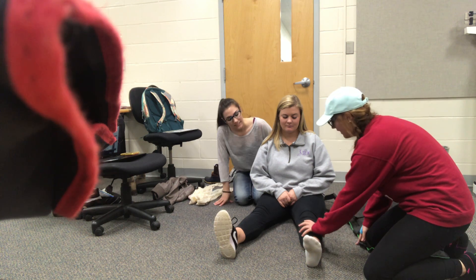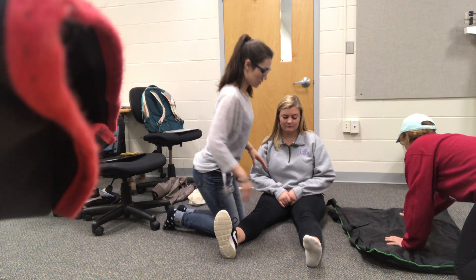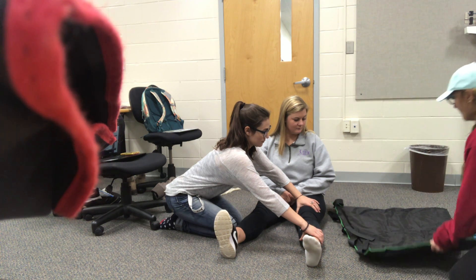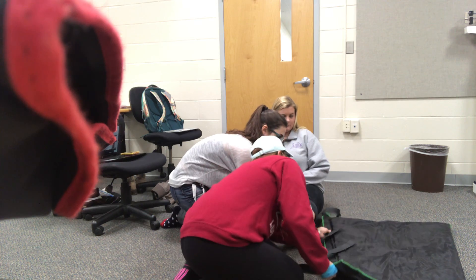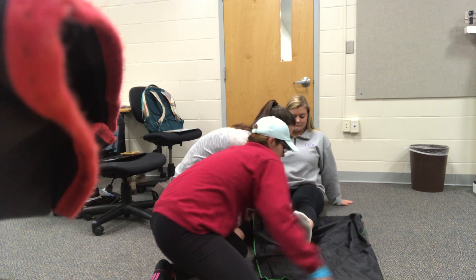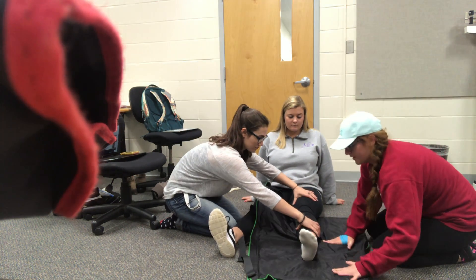And then Rachel, time to get you to stabilize below her knee and above her knee. Make sure the beads are equal. I'm going to get you to go under them, so I can look and go under them. You can lay it down, and then still apply support in here.